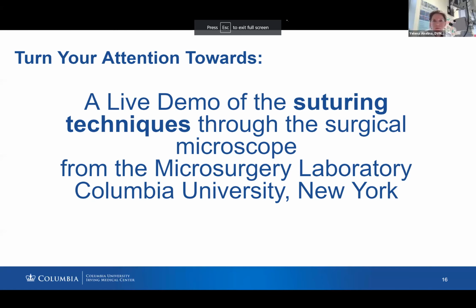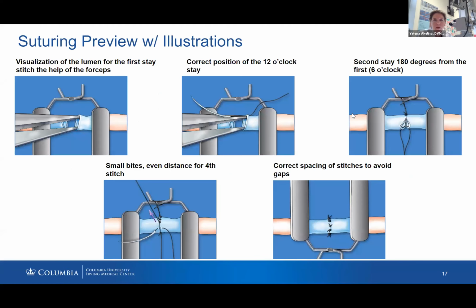We did this. And we're gonna go into the microanastomosis. So this is how we start on the rat.